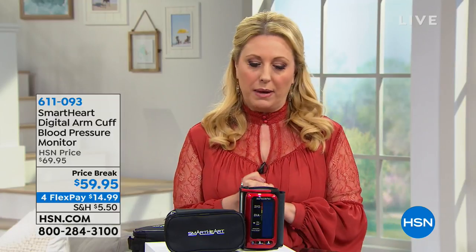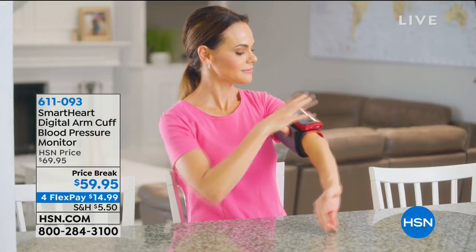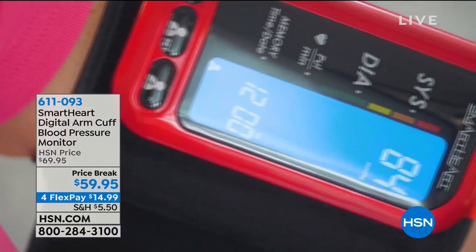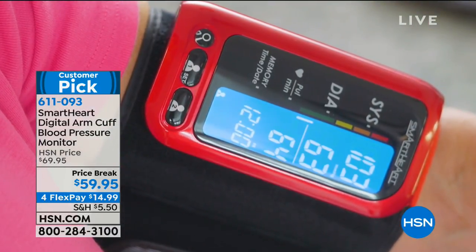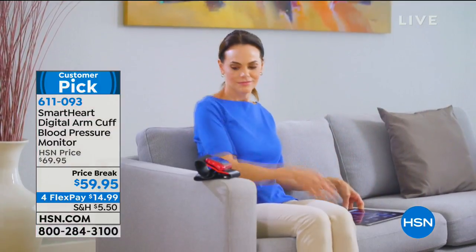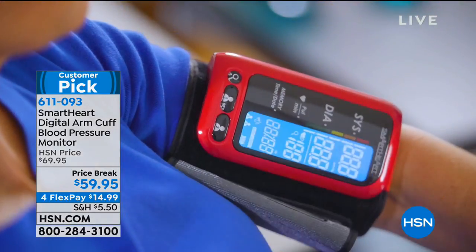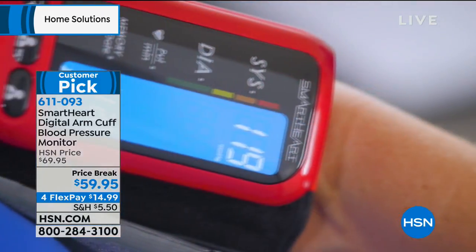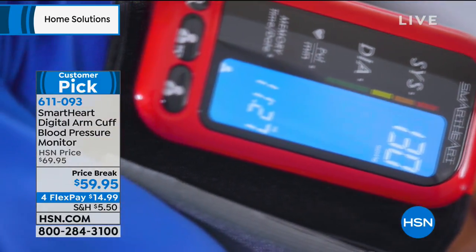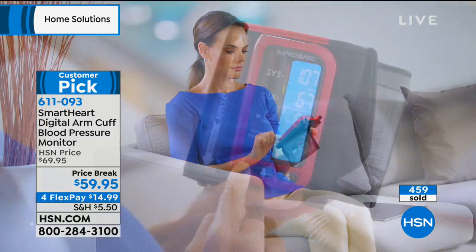We're going to talk about this blood pressure monitor with a true expert — registered nurse Matthew Peters, Medical Matt. We're going to jump over to the couch with Jennifer, our model, who'll be showing us this. Right away, I want to mention that this is not only a customer pick, but it is a perfect five-star customer pick. That means everybody who took the time to write a review decided it was a perfect five stars, and enough of you did it to become a customer pick.